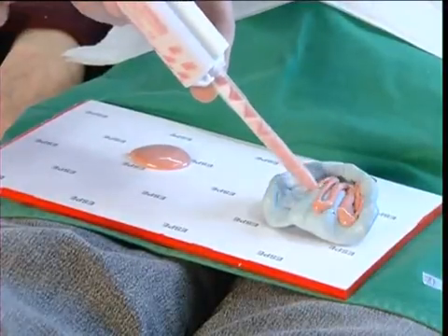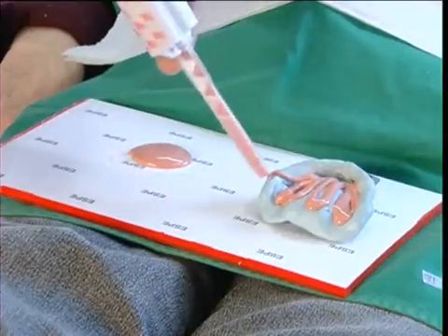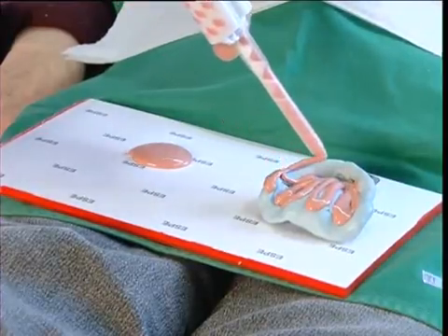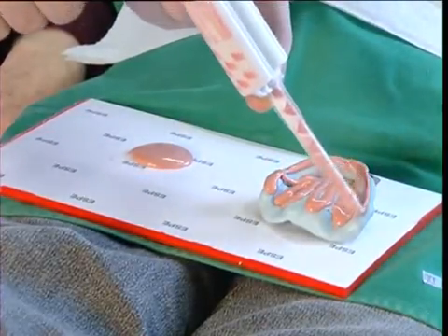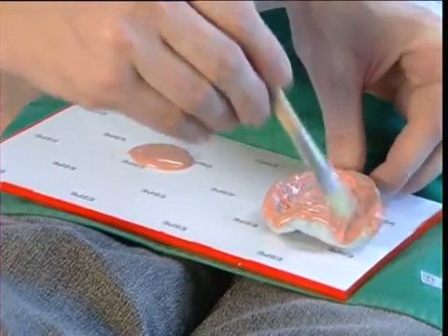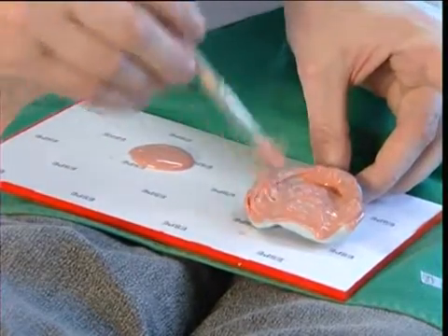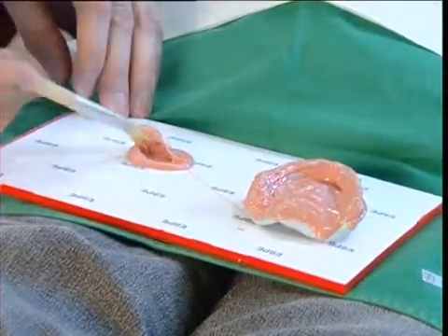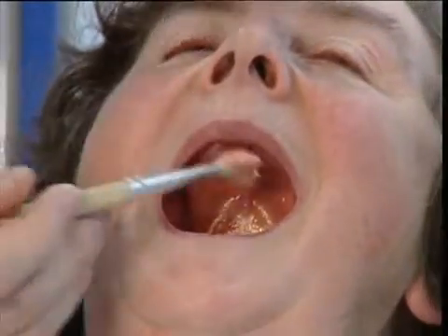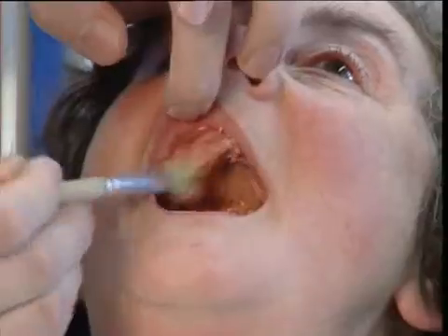The wash impression is then taken with blue regular viscosity or pink low viscosity material. In both cases, the wash material is applied straight onto the tray with a mixing tip. An extra portion on the mixing pad is applied to the mucosa directly with a brush.